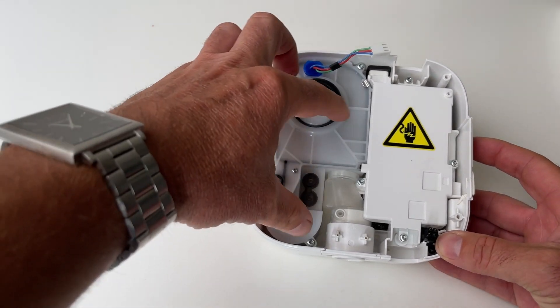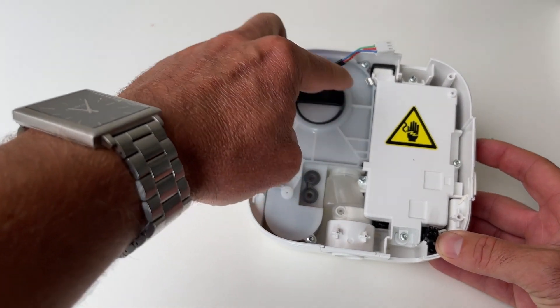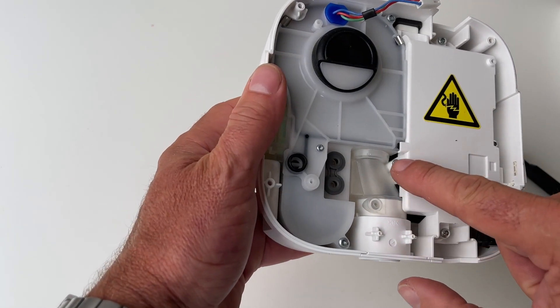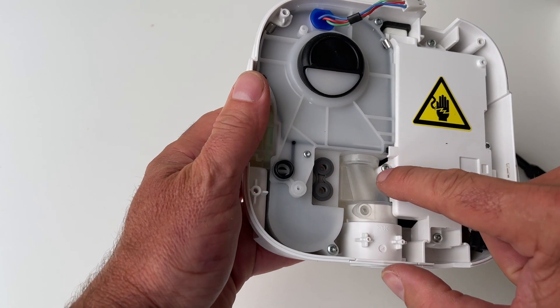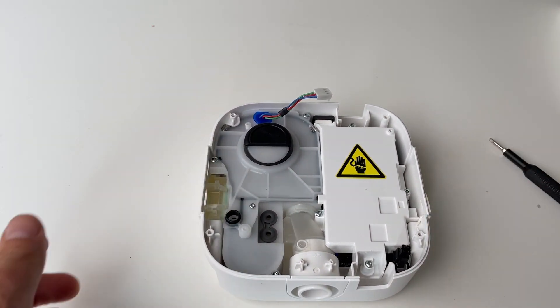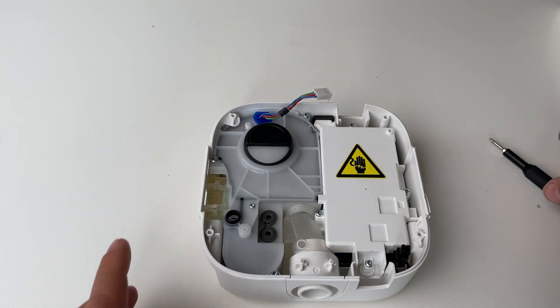Now the foam itself is in this little section here, so we need to take out the turbine casing. This is the turbine casing here, but to get to it unfortunately there's just this tiny little part here, so we actually need to take off this section as well. These are the largest screws so we'll take them off.